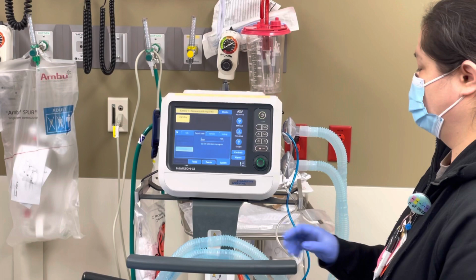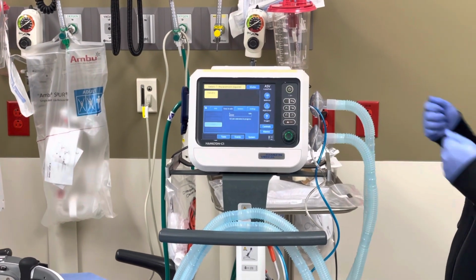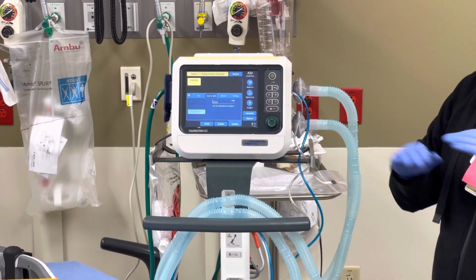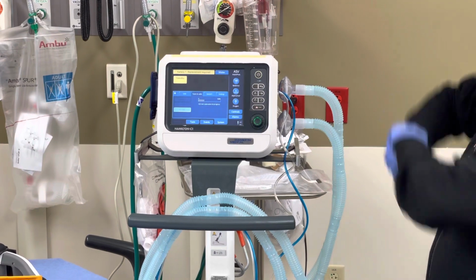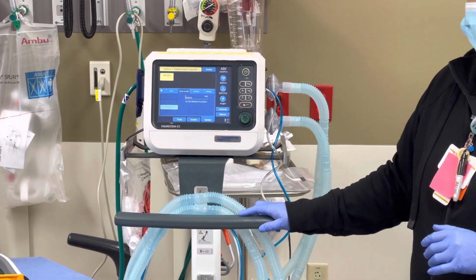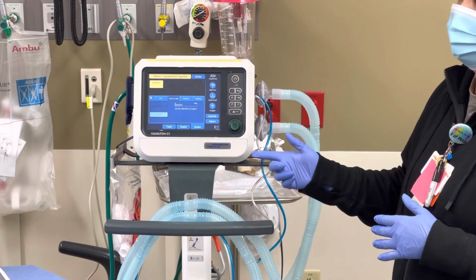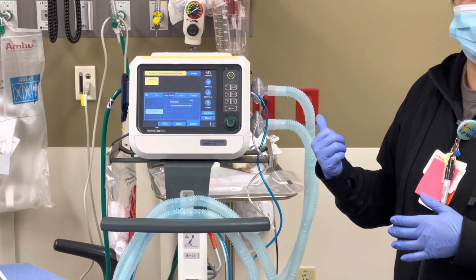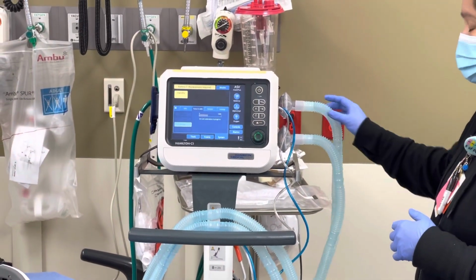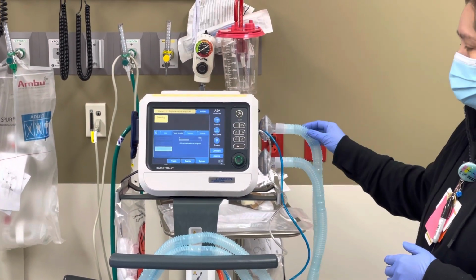Normally what we'll do is, after I've used it, I'm gonna clean it. I'm gonna get everything brand new. I'm gonna run my EST. I'm gonna run my pre-op check completely through. If everything passes, once I'm good, I can bag this and it's good. But if it's dirty, you really do have to run that check. You can't bag a patient until this thing is done, because once you put the patient on, you're gonna hit so many alarms and you're not gonna understand why, and it could be because the flow sensor was bad or the circuit was bad.